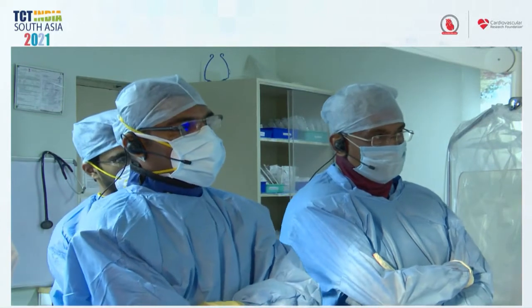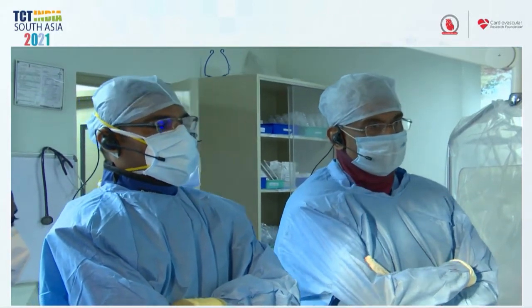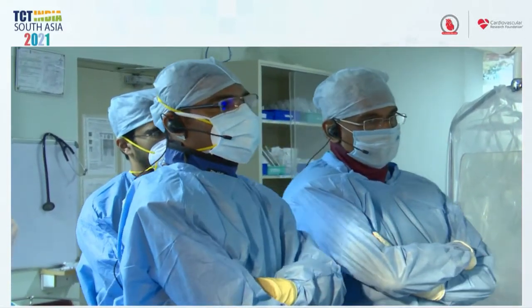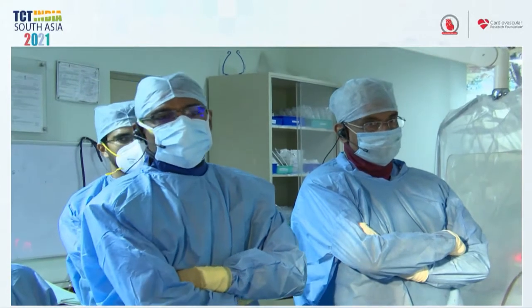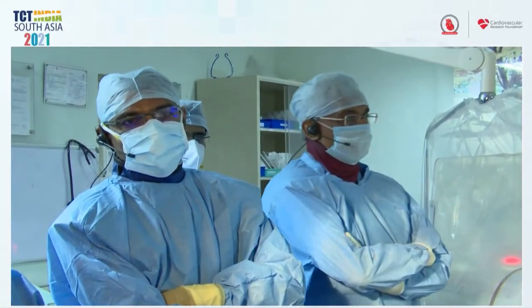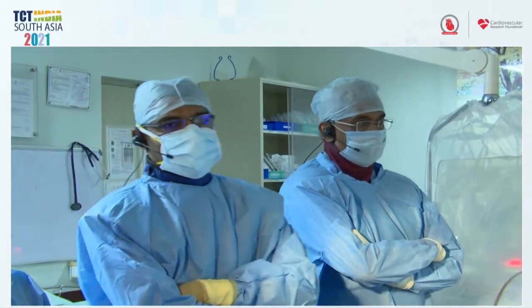This is just for the academic interest of people, to show you what imaging can do. And we dilated the ostium with a 3 millimeter balloon. So after that we did an OCT imaging. Just switch to the OCT screen, please. Let Jihad comment on this. Just switch to this and stop when that ISR comes. First image, Arun. We can't see the OCT yet, guys. Okay, we're just going to get you the OCT images.